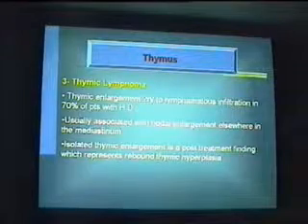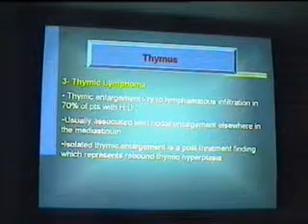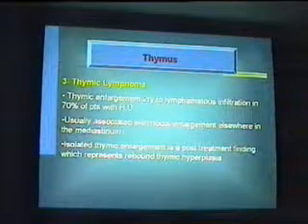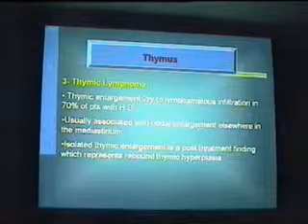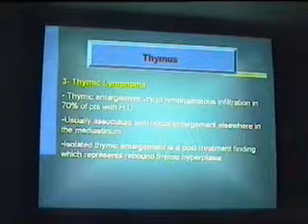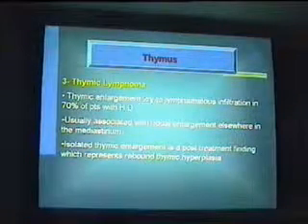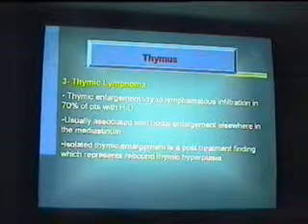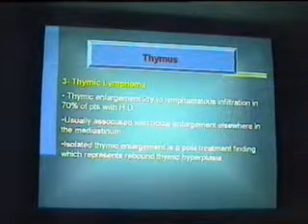كانت عيانة بنت صغيرة كان عندها يمكن 11 أو 12 سنة وكان عندها Hodgkin disease and she was treated وبقت فاين كل الميديستان اللي وجت بعد فترة for a follow up when she is completely perfect. وأنا اللي كنت بشوفها قبل كده وشفت إن everything has went fine بس مرة واحدة صار لها anterior mediastinal mass ف I thought ان that's a rebound of the disease.